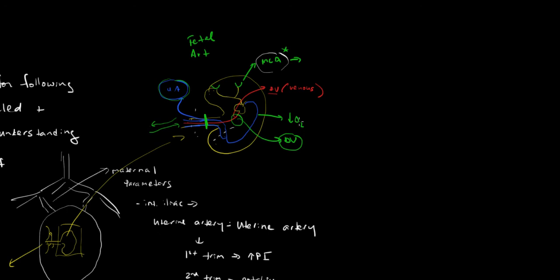So let's focus on those aspects of the fetal circulation that pertain to supply and return from the placenta. The supply to the placenta is represented by flow in the umbilical arteries. Incidentally, the sonographer could look at umbilical artery flow in the umbilicus or in the fetus itself next to the fetal bladder. So when the sonographer is counting the number of fetal umbilical arteries, they often count in both locations to see if there are two arteries, both at the level of the bladder as well as at the level of the umbilical cord.